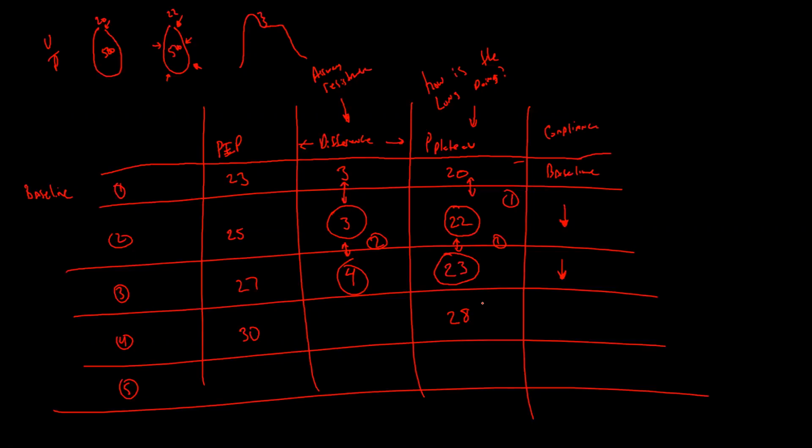Okay, so first of all, before we do step 1 and step 2, let's fill in the difference between the two. Okay. All right. Tamisha, is this patient getting sicker, better, or staying the same? Okay. So looking at the plateau, they would be still getting sicker. Excellent. Okay. So this patient is getting sicker. Good. You did step 1 perfect.